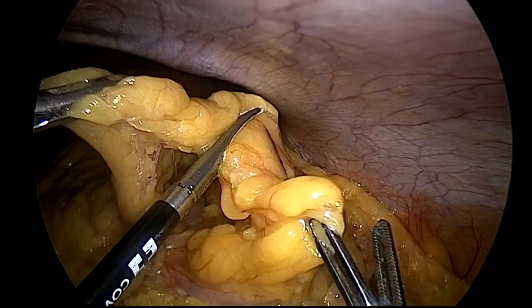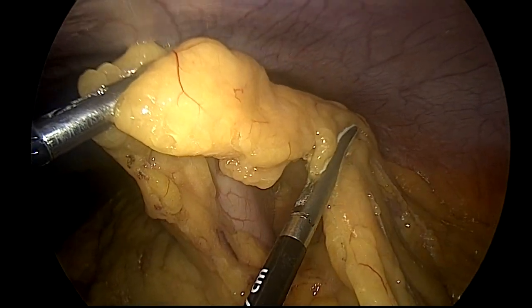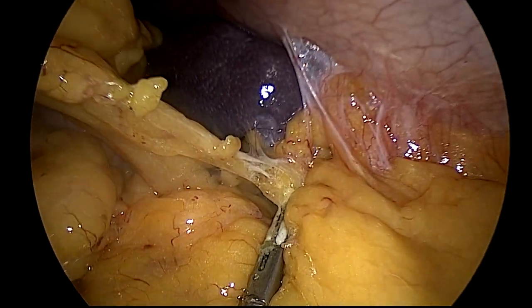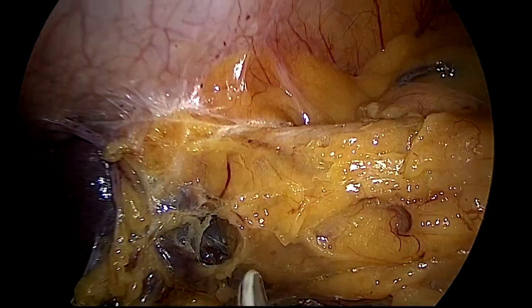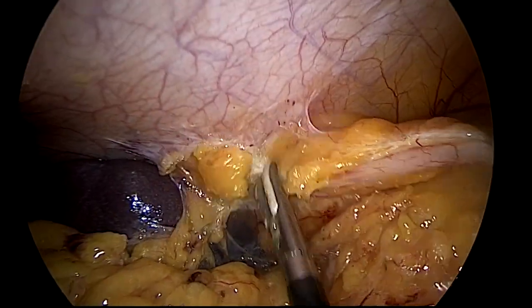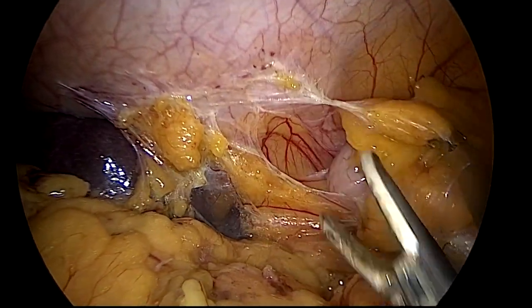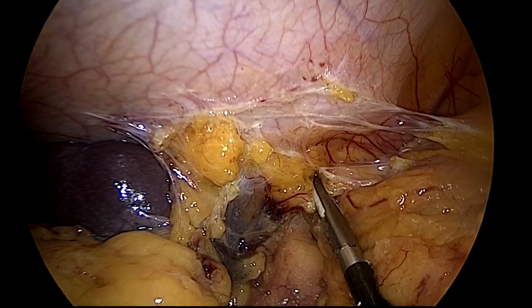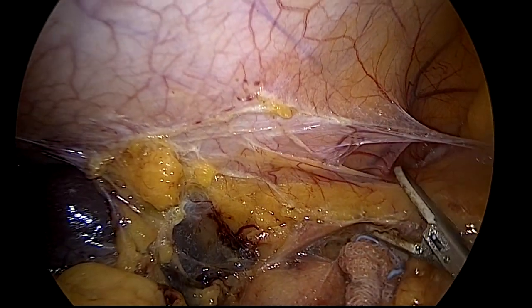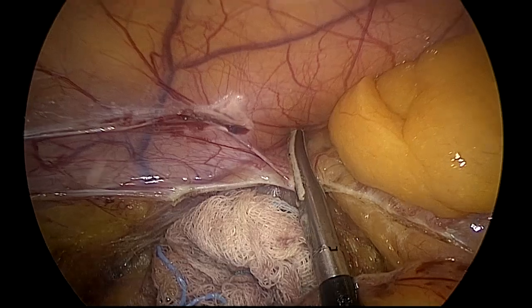Supra-colic splenic flexure mobilization now begins by dividing the gastrocolic omentum and visualizing the posterior wall of the stomach — you can see it over there. Caudal and lateral traction by the assistant on the omentum and mesocolon facilitates this dissection. We extend this dissection as far as possible to the descending colon laterally. The medially placed gauze piece can be seen there guiding that plane. The splenic flexure is thus completely mobilized now.